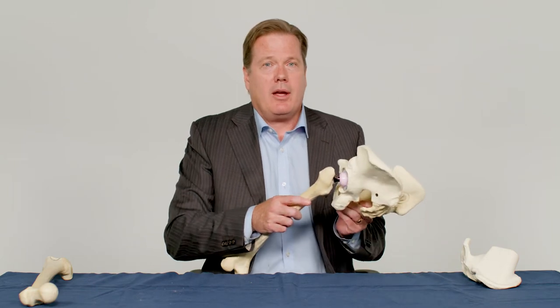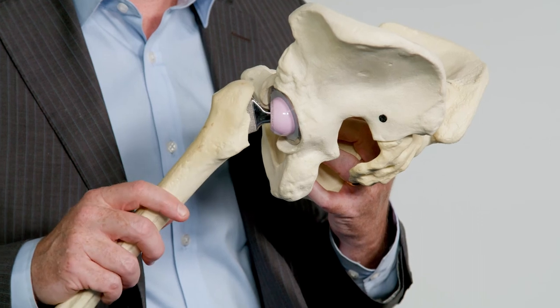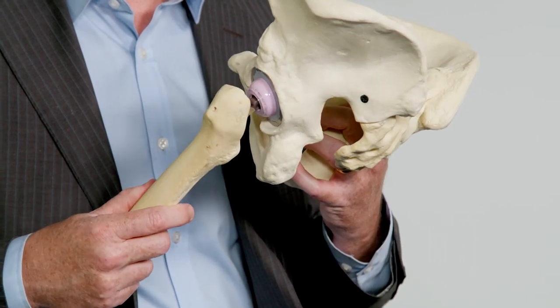Hip replacement surgery usually takes 60 minutes or less and is commonly performed under spinal anesthetic with some intravenous sedation to minimize patient awareness or anxiety.